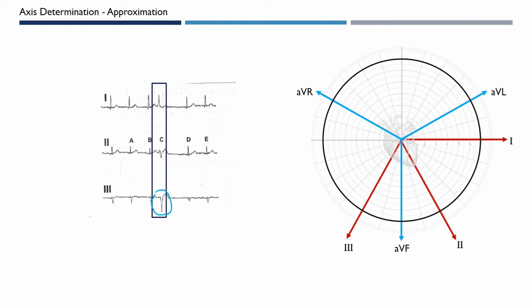So let's do the approach where we look at whether it's a positive or negative depolarization and shade half of our circle. So for lead 1, we know that it's somewhere in this green space. And for lead 3, we know it's somewhere in this blue space. And that puts us in this intersection area, denoted here in this turquoise color.